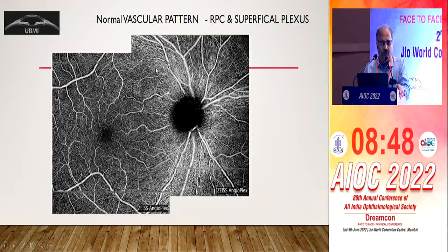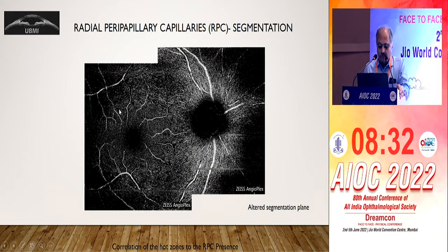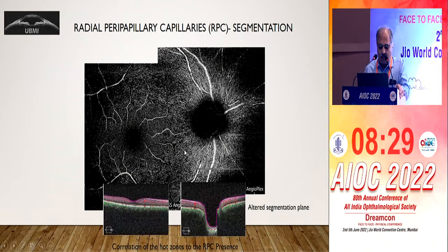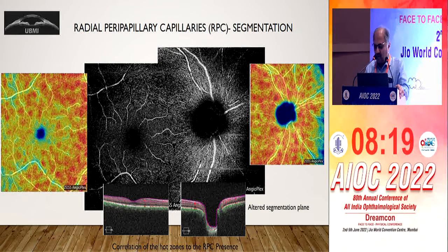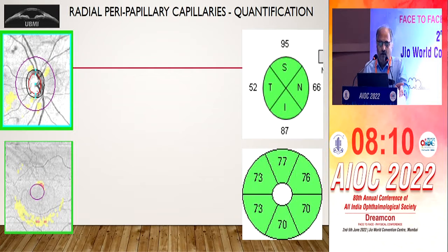Now see, there are two groups of blood vessels here. These radially going vessels which are along the arcades here are the radial peripapillary capillaries, and this branching pattern that you see here is the superficial plexus, okay? Now, what we do in our routine RNFL analysis is what we see as the radial peripapillary capillaries. So if you see here, these are only the radial peripapillary capillaries. They can be quantified, sorry, with color coding, and you can see all these red lines are radial peripapillary capillaries. And these are the first ones to be affected because of glaucoma, right?